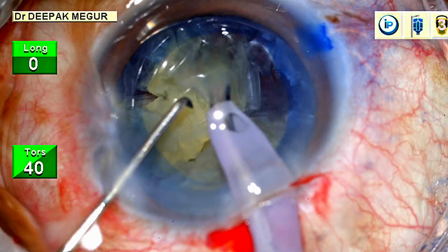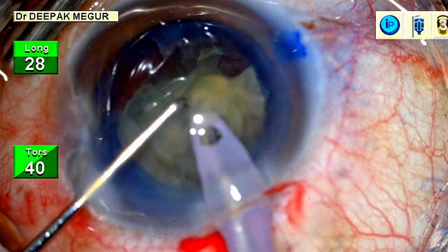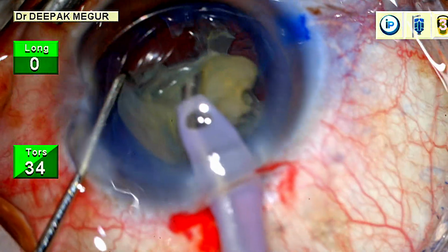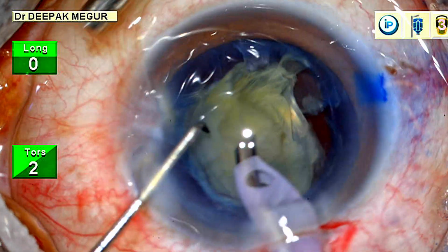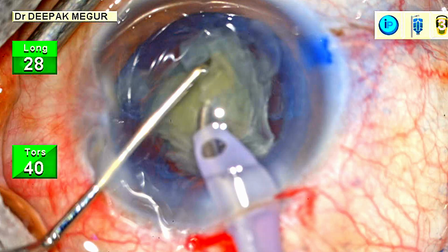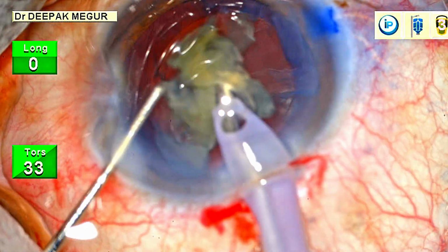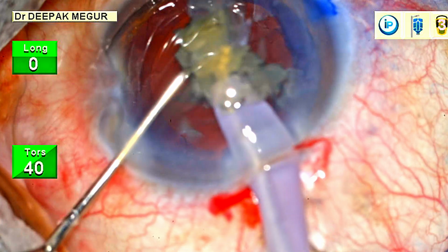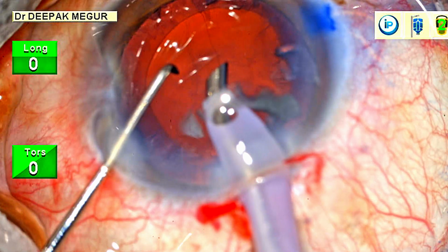Well, the speed at which the nucleus descends down into the vitreous cavity primarily depends upon the consistency of the vitreous. A gel-like vitreous prevents the sudden dropping down of the nucleus, whereas with a more degenerative or a syneretic fluid-like vitreous, the nucleus can just drop down in a jiffy. Well, I was grateful that the vitreous did support me in this case, and thankfully there is no nucleus drop.